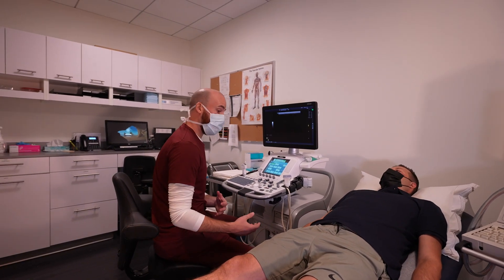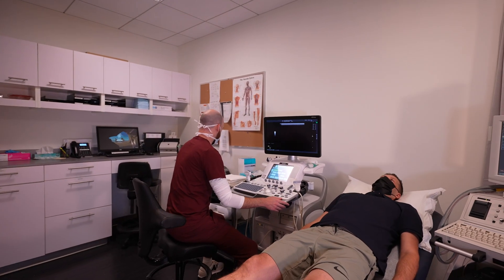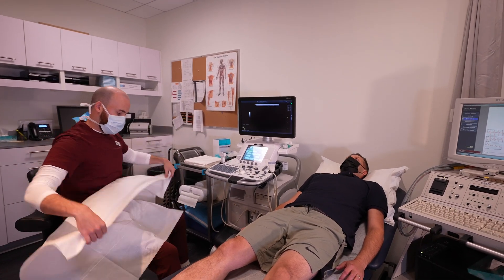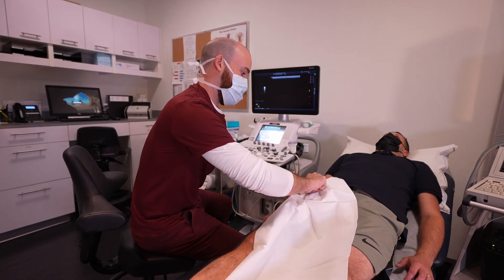Once the patient is changed into the appropriate attire, they will then be asked to lie down on the ultrasound bed. The technologist performing the scan will explain the procedure, where they're going to be looking, what they're going to be looking at, and what happens with the patient's results following the exam.